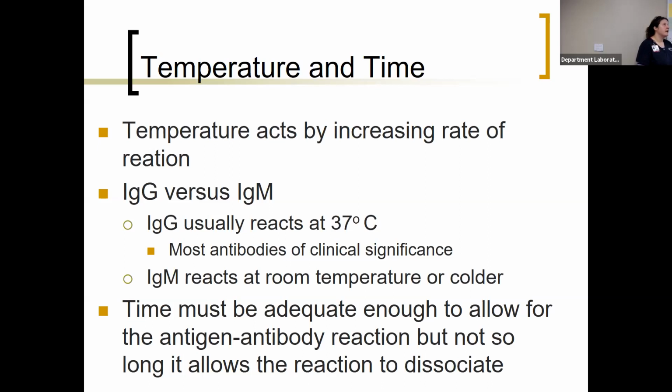If you're dealing with an antibody, you're trying to get it to react, oftentimes we will extend that incubation time to 30 minutes. And that's usually a standard step that we take in blood bank. However, as you start doing your IATs, you don't want to cause such a delay in your testing. I actually had this happen to me in blood bank. I was notorious for incubating my tubes, setting my timer, walking away, and then I kind of became obsolete to my timer.